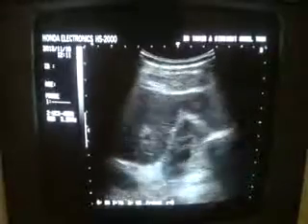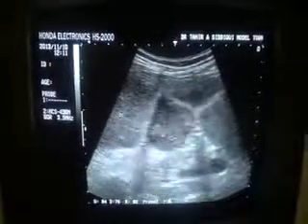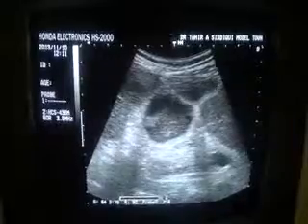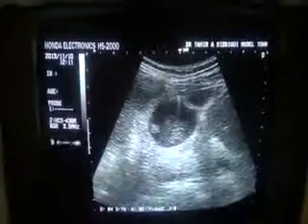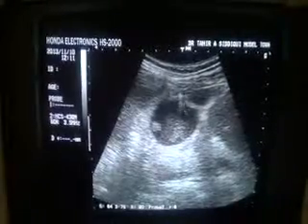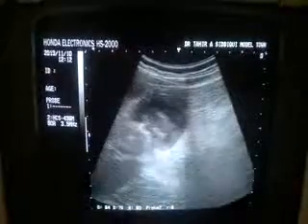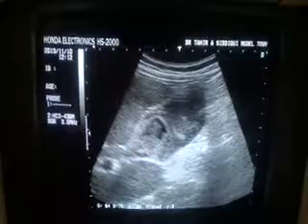So, this is a case of gallbladder pathology. Is it emphysematous? Yes, it can be — because here you can see this small echogenic particle giving a comet-tail artifact, suggestive of gas. So emphysematous gallbladder or gangrenous gallbladder — the possibility of these two cannot be ruled out. Thank you.